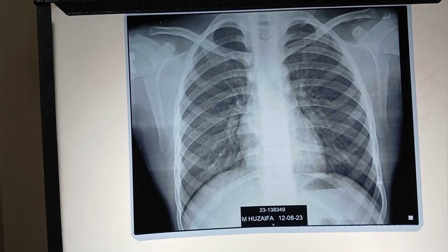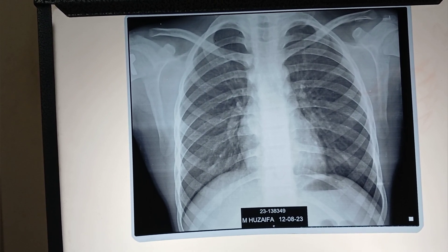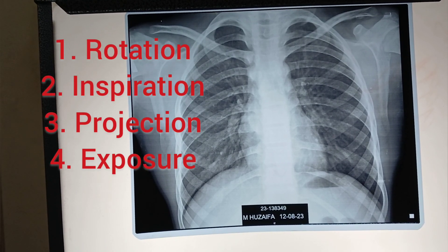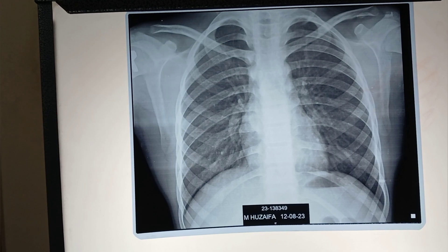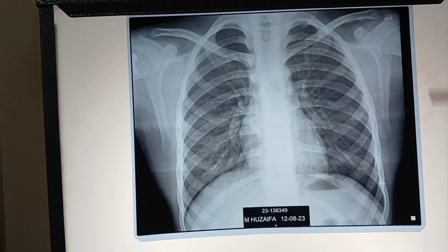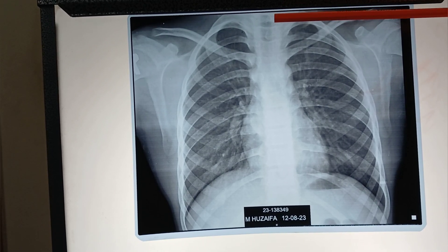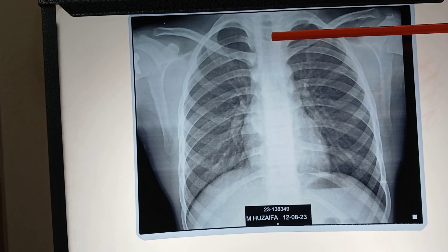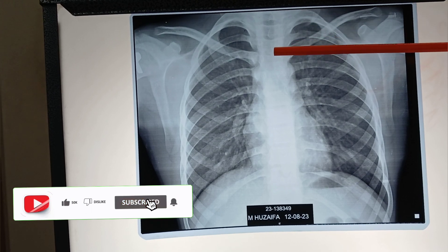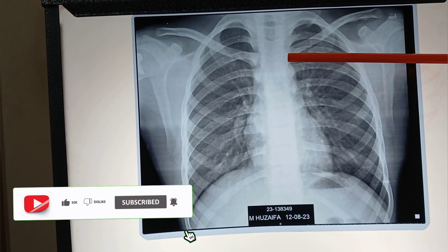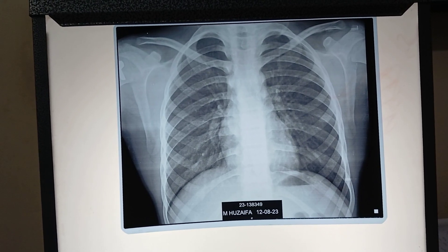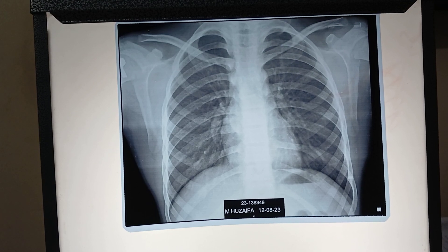The next point is to assess the quality of the image. Four points: rotation, inspiration, projection, and exposure. To see whether the film is rotated or not, the spinous process should always lie halfway between the medial end of the clavicle. These raindrop-like structures are the spinous processes projected over the trachea. They should be in the midline and equidistant from the medial end of the clavicle. If the patient is rotated, interpretation of the X-ray becomes difficult as trachea and heart size cannot be commented upon.